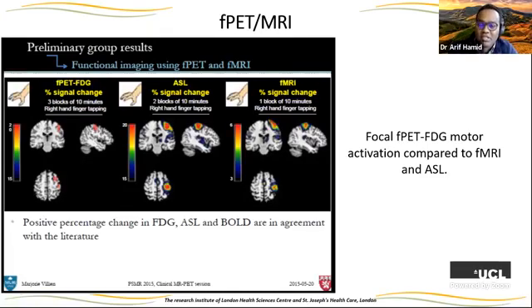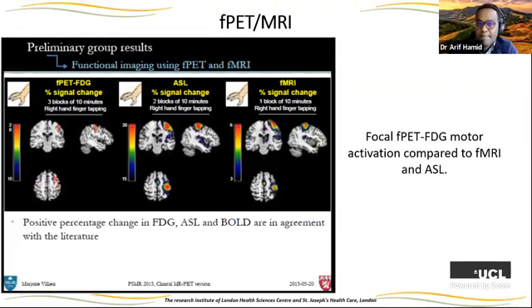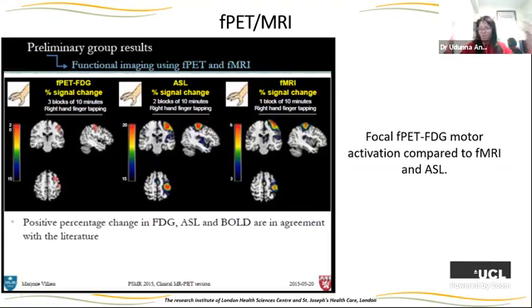Yeah, so that's how it started off. It started off with continuous arterial spin labeling. That's essentially what you did. You had to use a coil to transmit your signal, and then use a separate coil to acquire and read out your signal. So CASL, that's how we started.